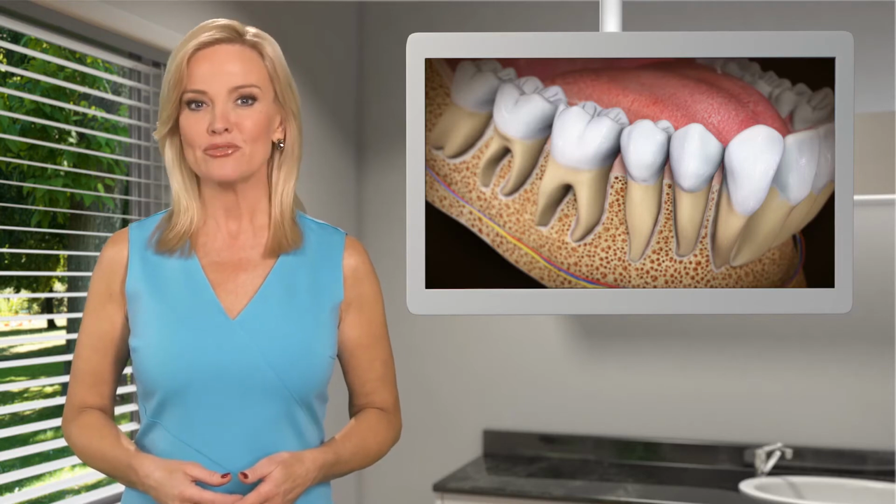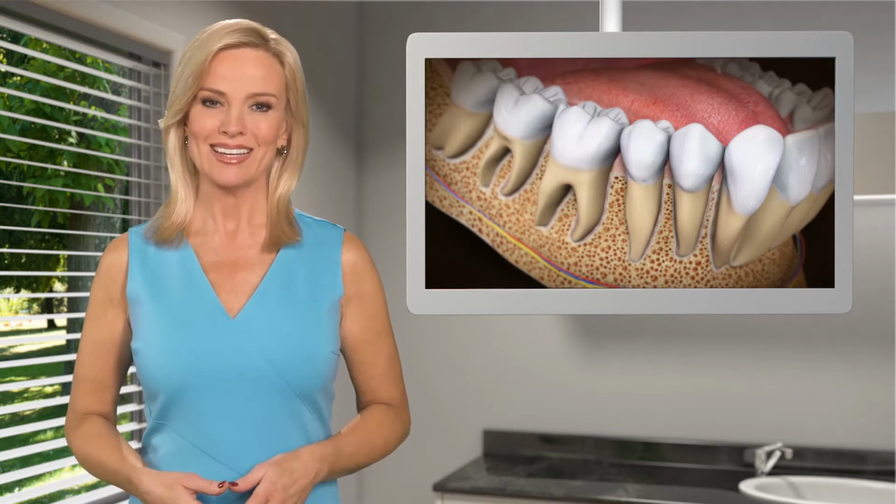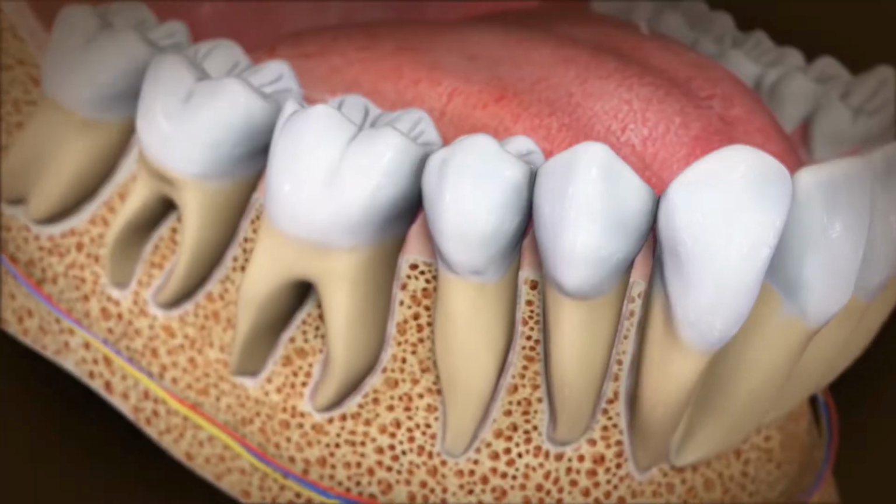You might think it's very hard to remove a tooth because it's firmly attached to the jawbone, but that's not really the case. In fact, the tooth is held in place inside its bony socket by a set of elastic fibers. Your dentist will use special tools to gently manipulate the tooth, causing those fibers to loosen and disconnect.